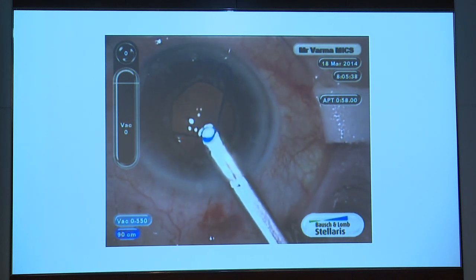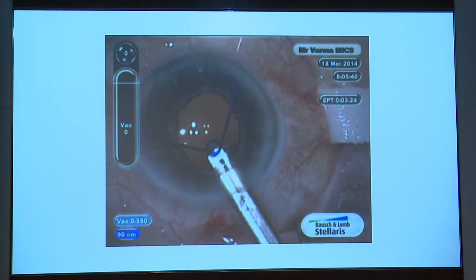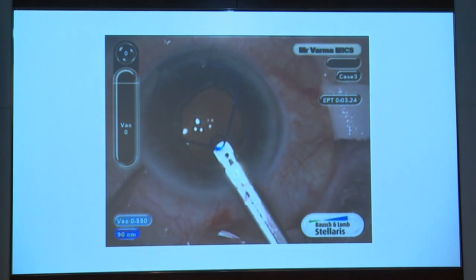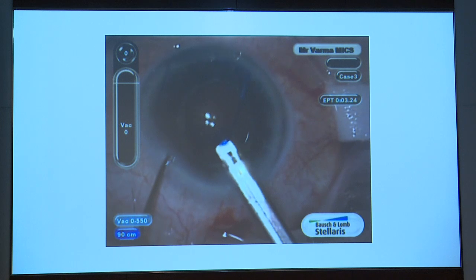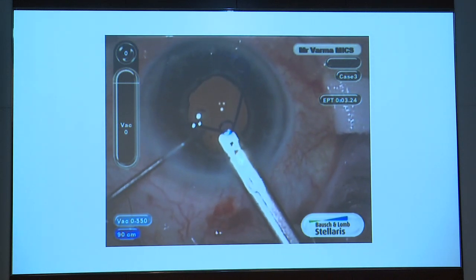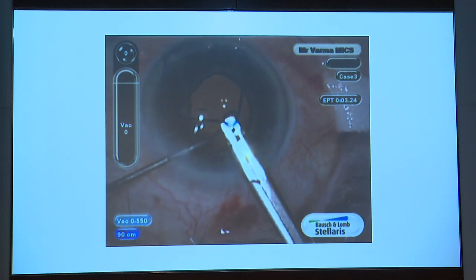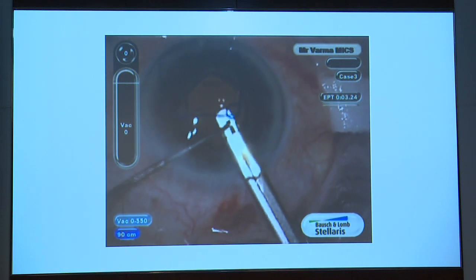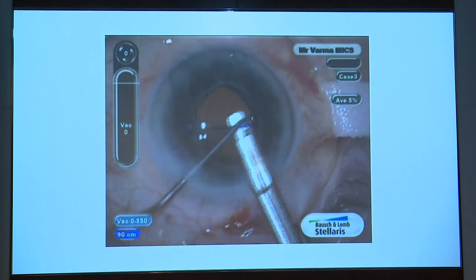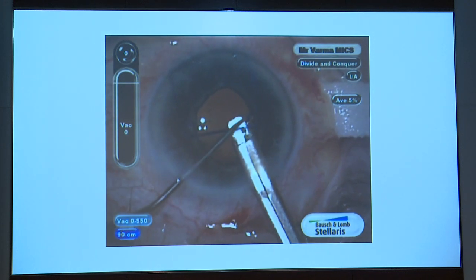And now you can use this injector to go from a 2 millimeter incision, and that's the good thing about it. You have to just go from the side port and catch it. So in this department, I think the BX is much simpler. You just have to hold it and pull it out. But once you get used to using this, it also works.